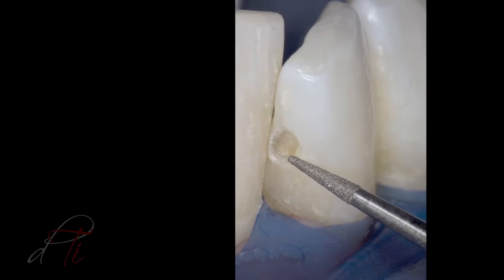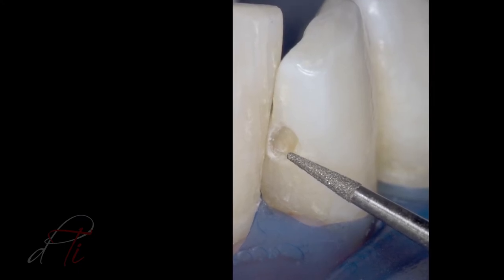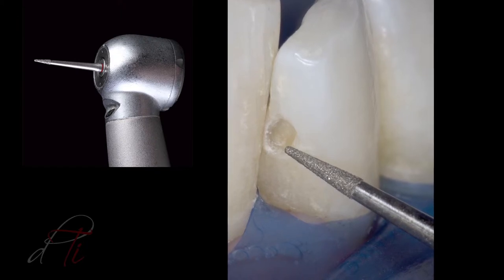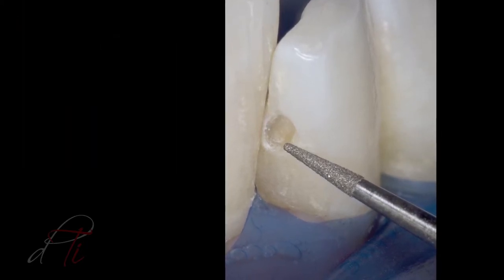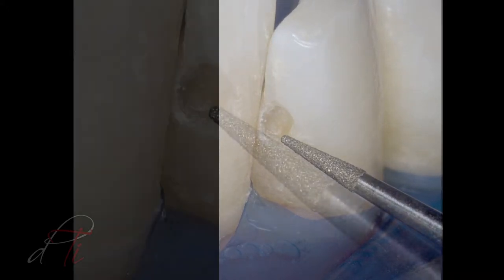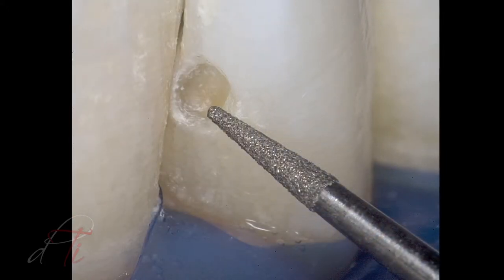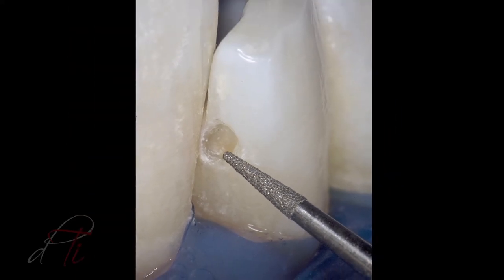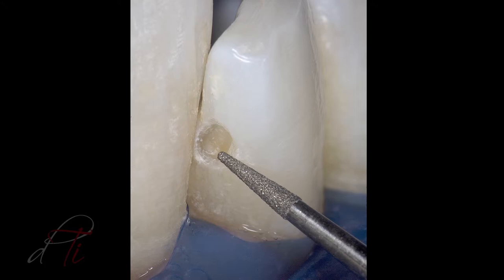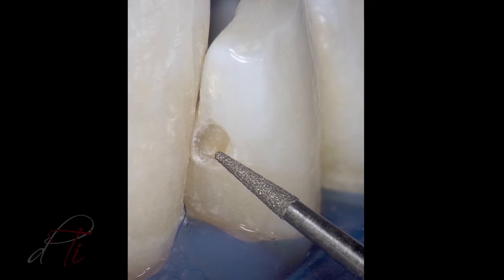A circumferential bevel is placed in enamel using a tapered diamond burr, a DET3 by Brassler USA. An enamel bevel is indicated because it increases the surface area for end-on etching of the enamel rods, resulting in an increased etched surface, a stronger enamel-to-resin bond, increased retention of the restoration, and reduced marginal leakage and discoloration.